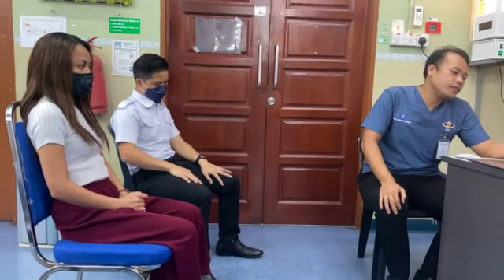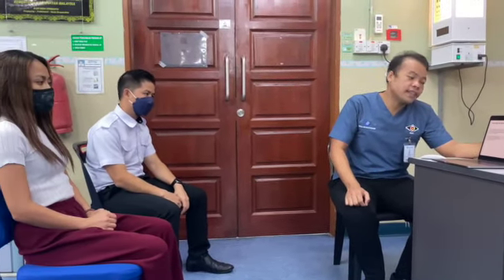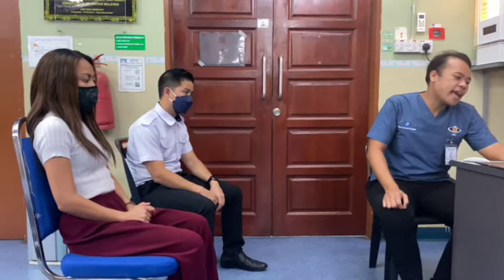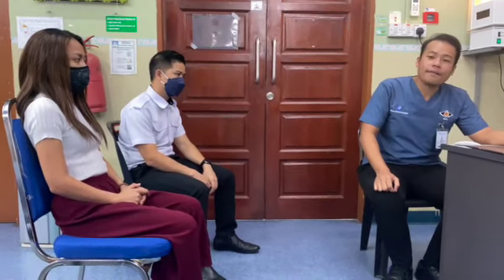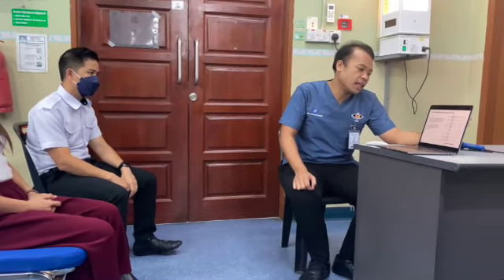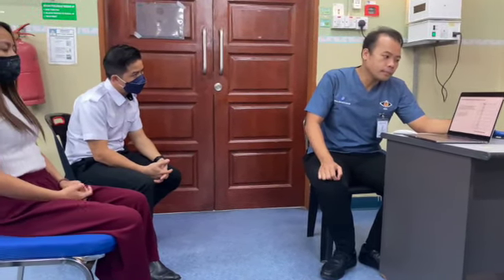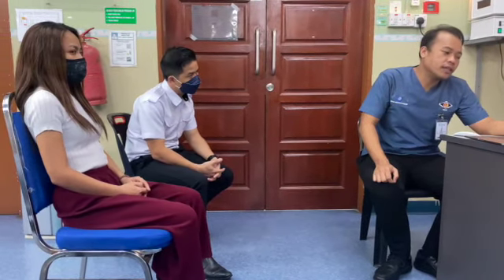Next, how to read the result of a visual acuity test. Visual acuity is typically measured in fraction or decimal. The first number in the fraction refers to the testing distance, and the second number refers to the font size. Most visual testing in the United States uses the Snellen letter chart, which requires a test distance of 20 feet or 6 meters. Normally in Malaysia, we use meters. The normal vision is 6/6.